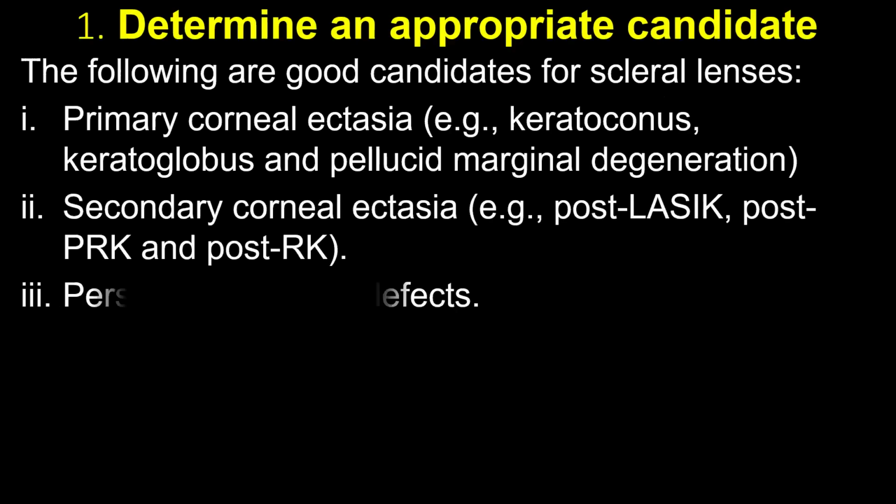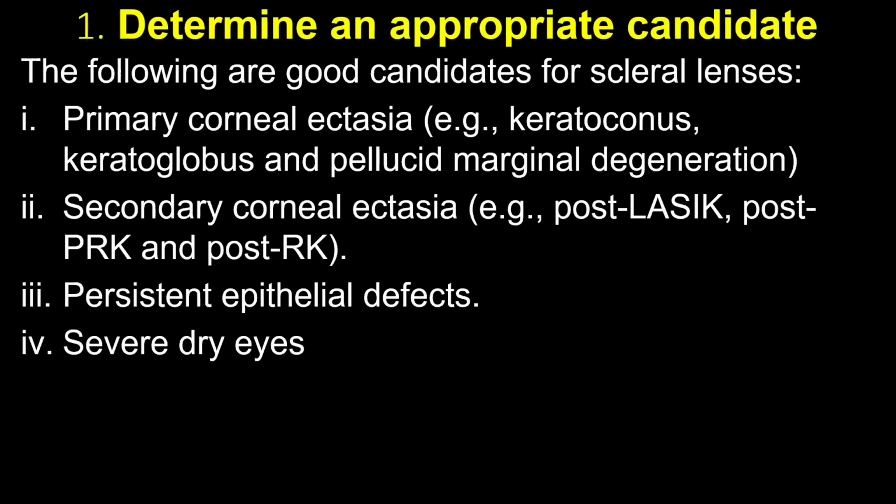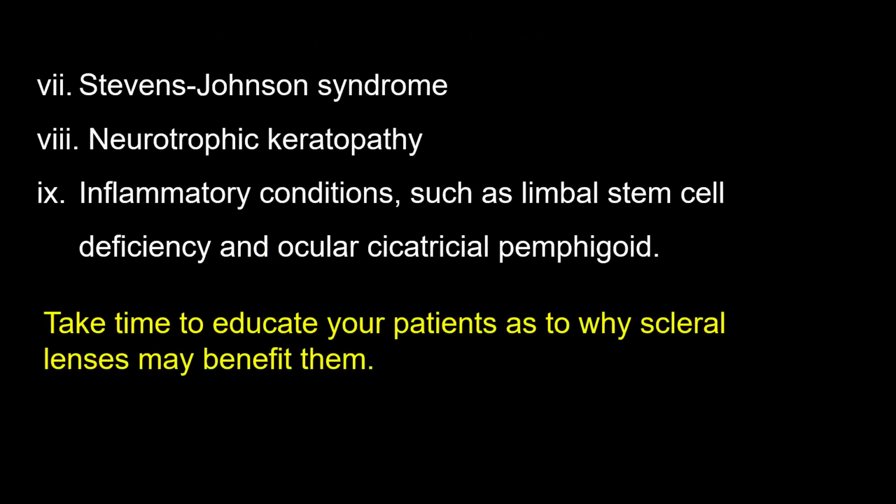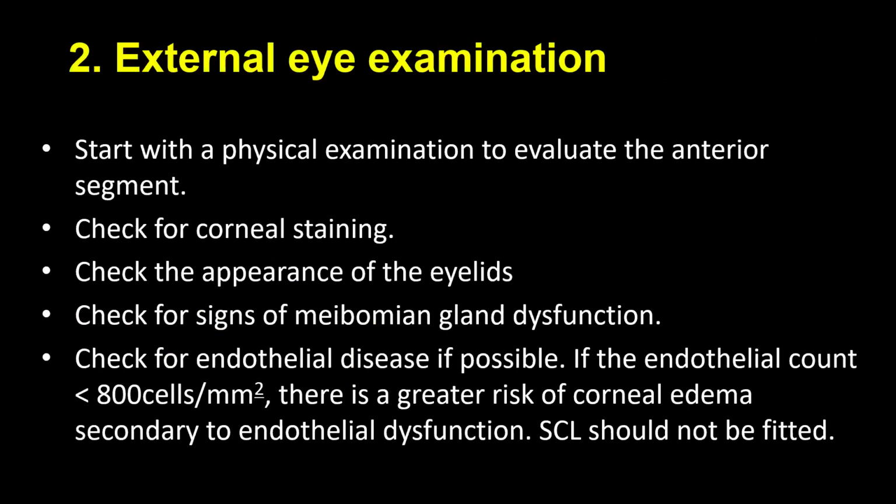I think I need to move on quickly. So patients who have these conditions will benefit a lot from it. They are good candidates for scleral contact lenses. They are good candidates. I think I've mentioned that. We can't overemphasize that. Then, cases of dryness, severe conditions that affect the cornea.